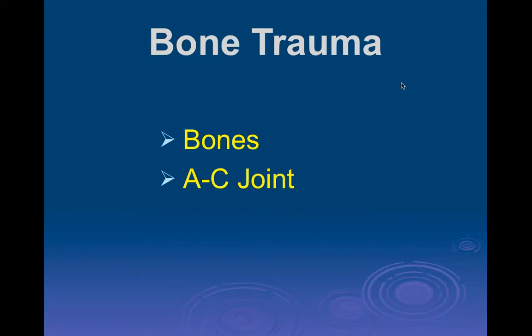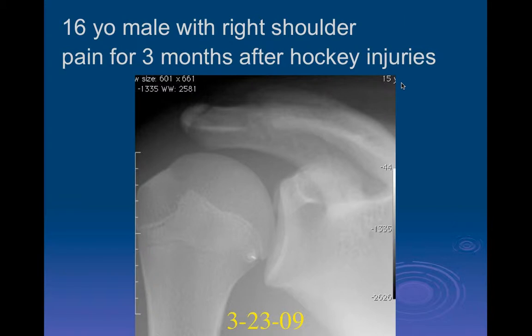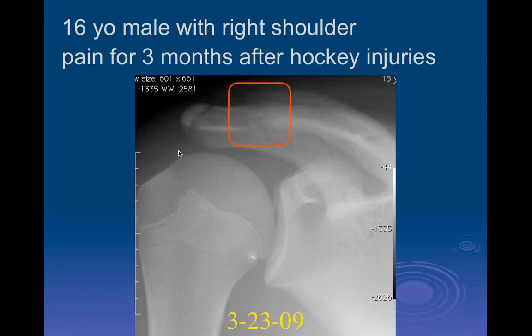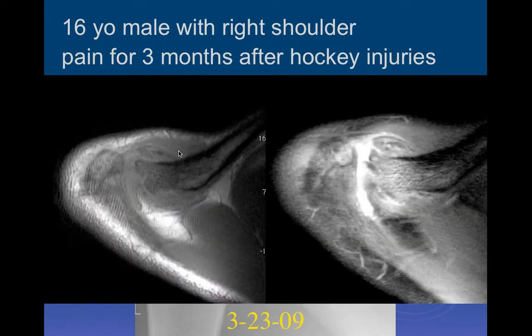Let's go into bone trauma. Here's a 16-year-old male with right shoulder pain for three months after a hockey injury. We have a single AP view of the shoulder. The humeral head looks okay and I don't think it's dislocated, though I only have one view. There's some irregularity of the distal clavicle and the AC joint. Since the patient is only 16, this could be an apophysis, but if it doesn't fuse later we should consider an os acromiale.